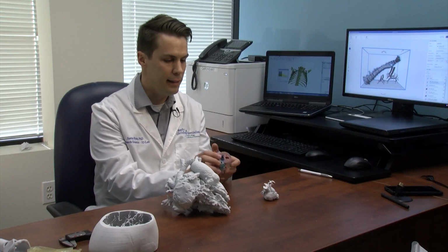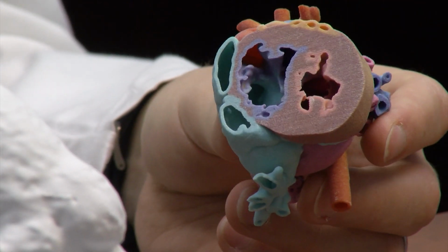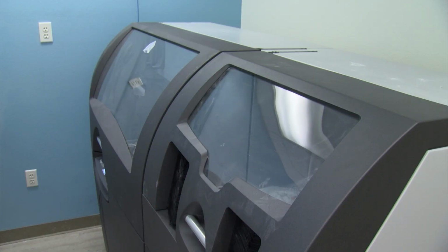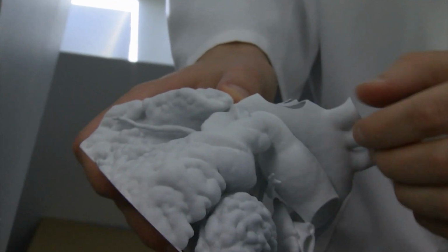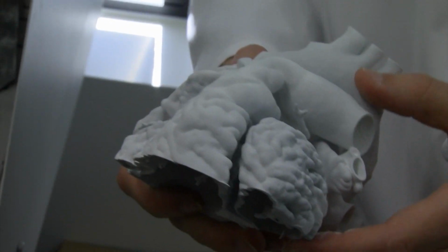Matthew's 3D model was created by Justin Ryan, director of Rady Children's Hospital's new 3D Innovations Lab, which opened in October. It's one of the first 3D hospital labs in Southern California. So inside here we can see all these muscle fibers. And in this patient, this area is a bit more narrow than what it should be. So we're helping our interventionalists figure out what size of a stent they might put in that region.